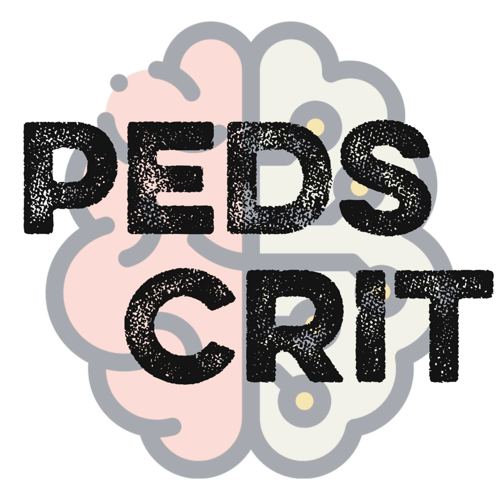We do the same, and the same for cardiac patients. As I mentioned, we have two different strategies in cardiac: decreasing the pressure for the right side and a weaning phase for the left side. But if the patient needs pressure, like a patient with multi-organ failure or a myocarditis with a low ejection fraction and in shock, of course you want the pressure that will help the patient, and switching them to NAVA will probably worsen them. So there are points where you want the patient to contribute to the ventilation, and there are situations where you want to take control. And that's important, and that's the safe way.